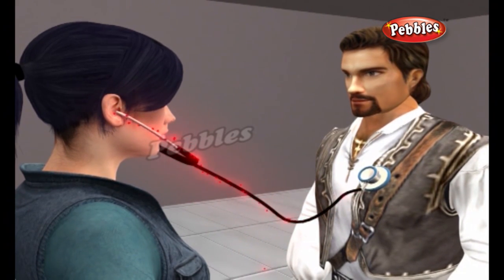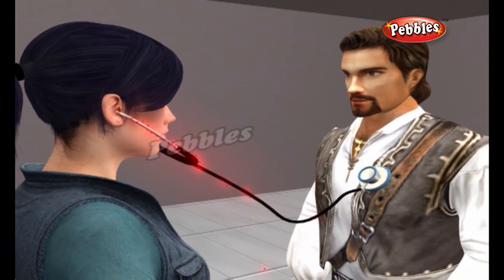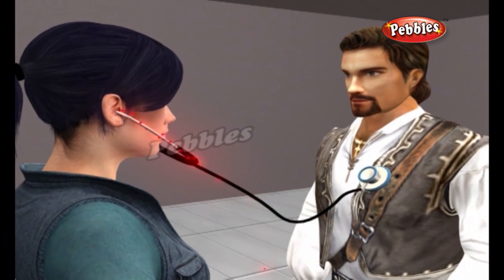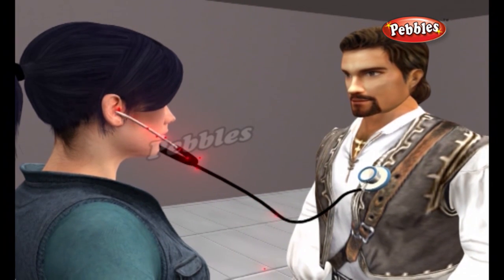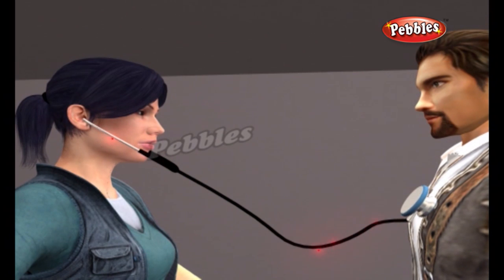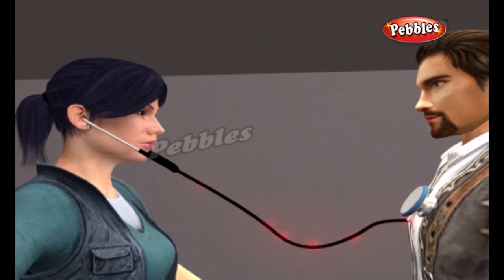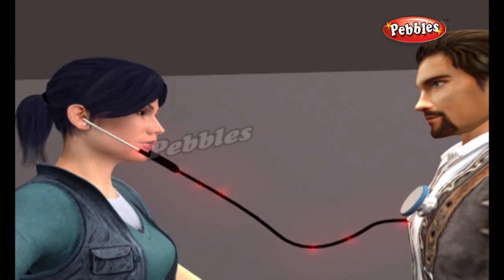If the bell is placed against the patient, the vibrations of the skin directly produce acoustic pressure waves that travel up the hollow tubes to the listener's ears. The bell side of the chest piece is used to transmit low frequency sounds.